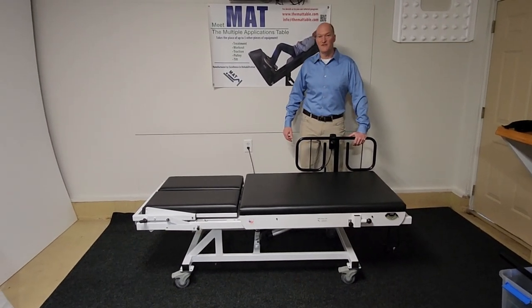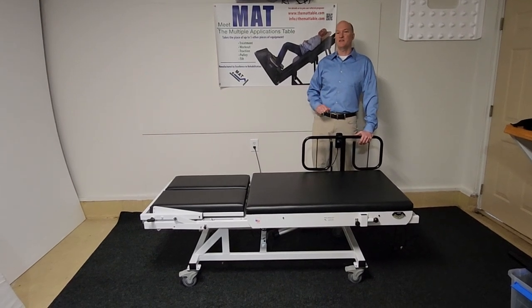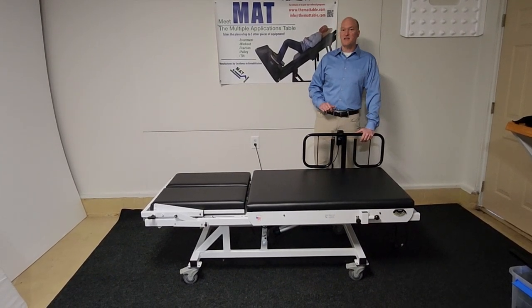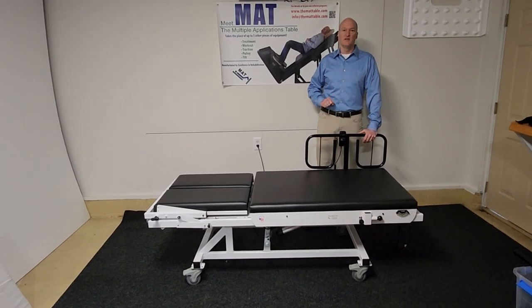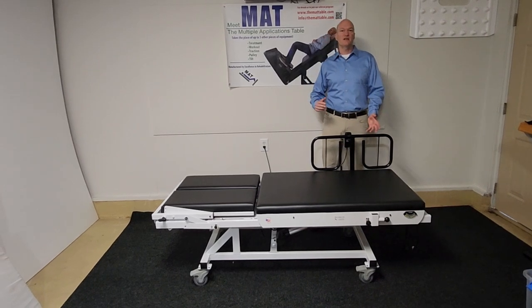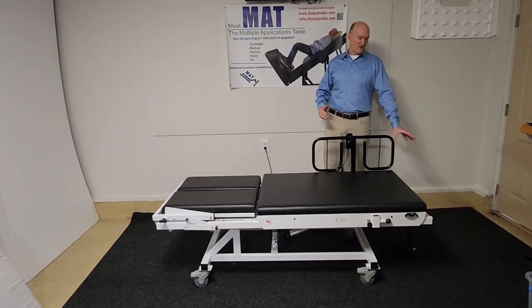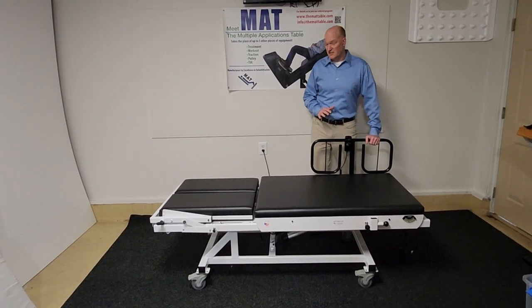Hello, I'm Brian Scherth, physical therapist and inventor of the MAT table, the Multiple Applications Treatment table. It is a product that does five functions in one item. It's a table, it turns into an exercise machine, it's a traction table, it's a tilt table, it converts into a pulley system, and today I'm going to show some of the features of this table.